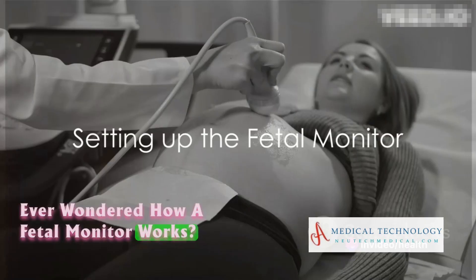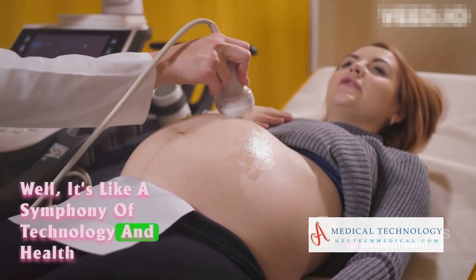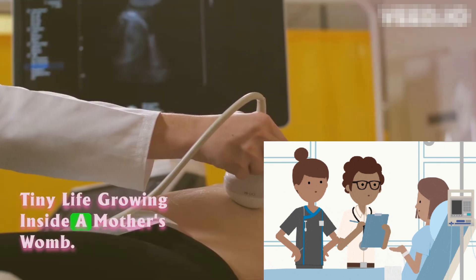Ever wondered how a fetal monitor works? It's like a symphony of technology and healthcare, creating a lifeline between medical professionals and the tiny life growing inside a mother's womb.